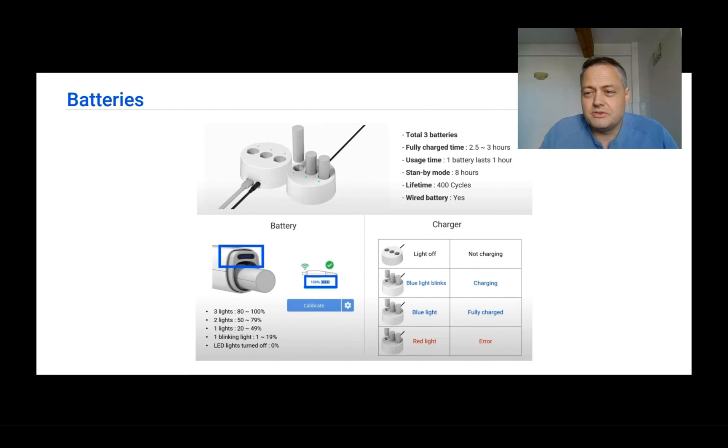If you forget to charge your batteries, don't worry — the i700 wireless box includes a wired cabled battery as a replacement. Plugging it into the scanner lets you continue scanning connected to the socket with no problem, even without wireless batteries ready. However, this is not a full wired connection — it just provides power to the scanner, so you still need to connect to the base.